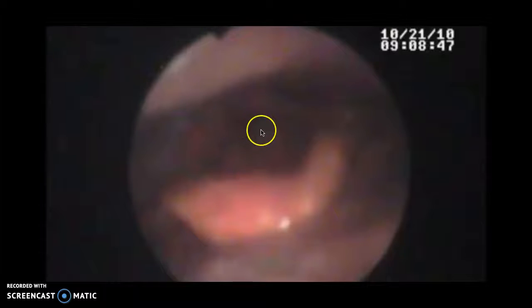So in this area here is the very back portion of your tongue, and this area back over here is the opening into your esophagus. So essentially what happens is this epiglottis, the leaf-looking thing, flops over into the airway, and it directs all the food out this way, which leads into the opening of your esophagus. So now let's take a look at your video and see what your swallow looks like.